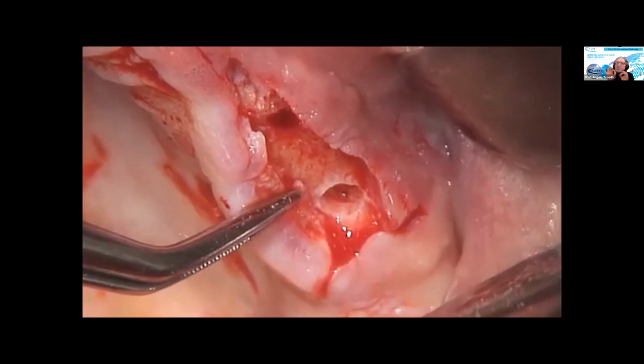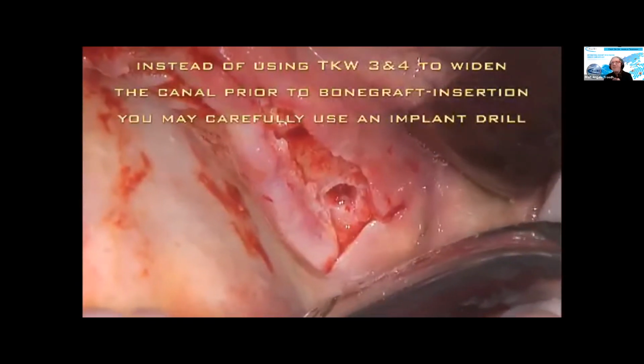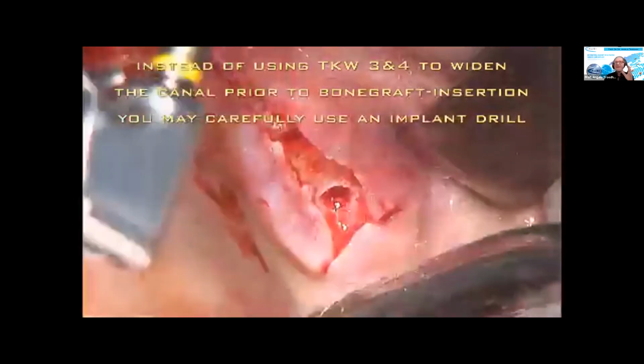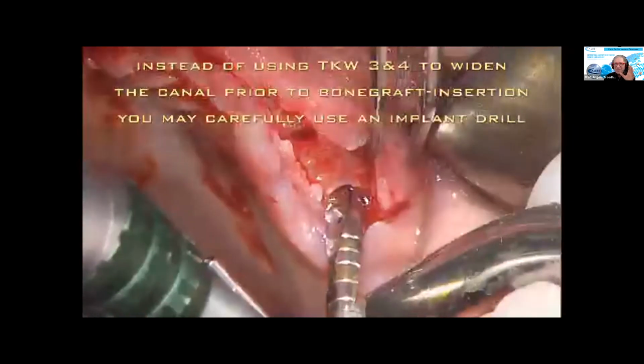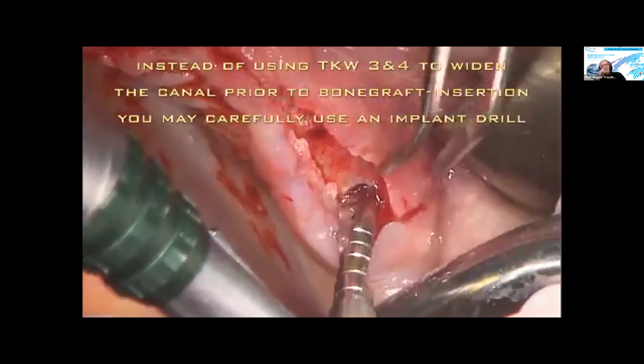Of course, you can gently take a sinus probe and touch the sinus membrane to have some haptic feedback. But anyway, however you do it, always keep in mind, sinus membrane, even if it's already loose, it can still be perforated, especially when you now do the next step.